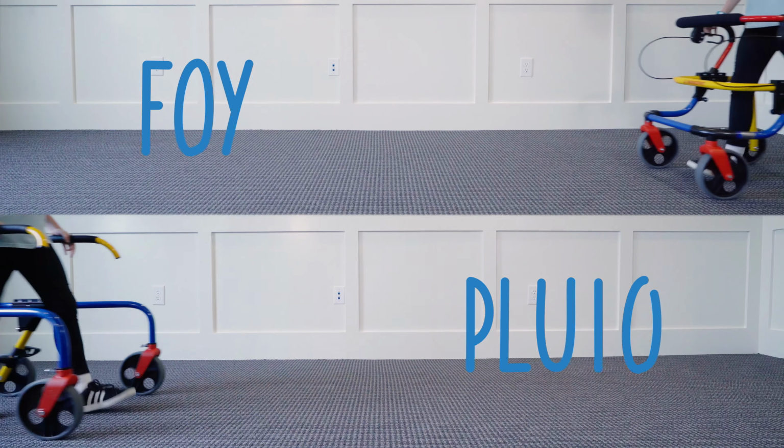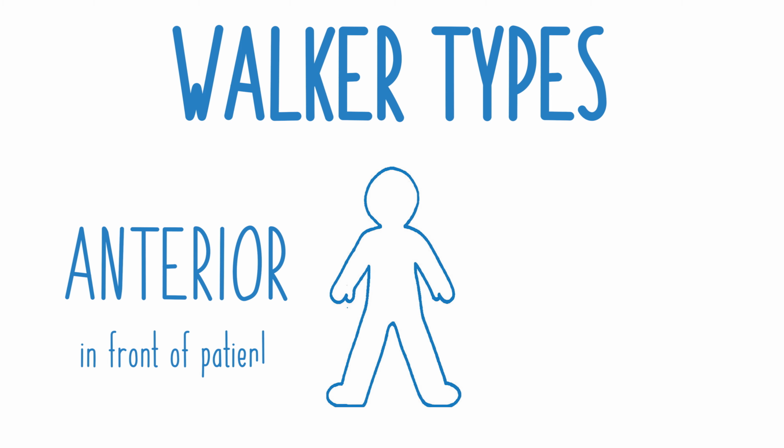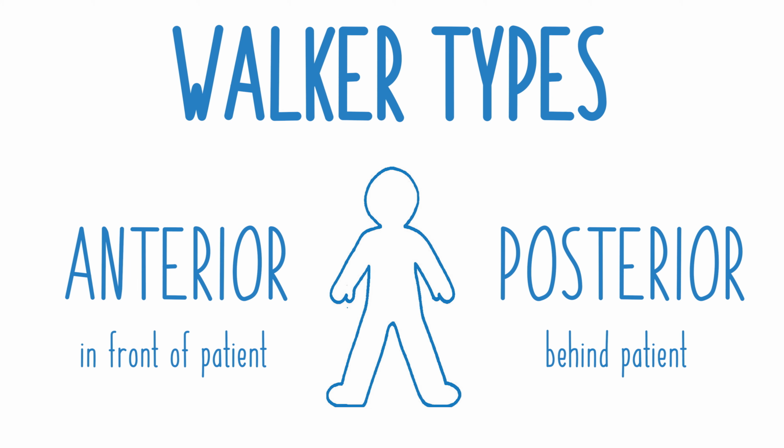Hi, my name is Megan Smith, and I have a daughter who is 17 years old who has cerebral palsy. I'm also a physical therapist for the past 21 years, and today I'm here to talk with you all about two Rebotec walkers and discuss the differences between an anterior versus a reverse or a posterior walker.